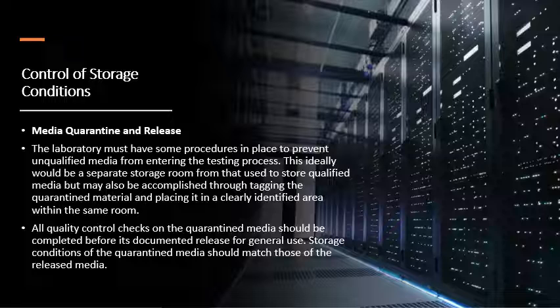There must be a room where quarantine media is kept. So all media must pass all quality checks before use, and they must be stored under the same conditions as approved by the label or by the protocol or SOP for each laboratory.